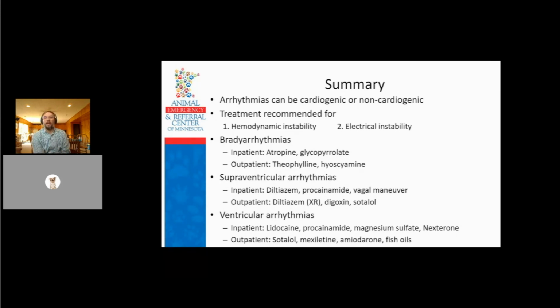If it's a really calm cat or a cat with GI disease, maybe it does have higher vagal tone from that. So I wouldn't say this cat definitely has sinus node disease when I see a sinus arrhythmia in a cat, but I'm going to be thinking about whether they have other causes of high vagal tone or drugs potentially affecting it.